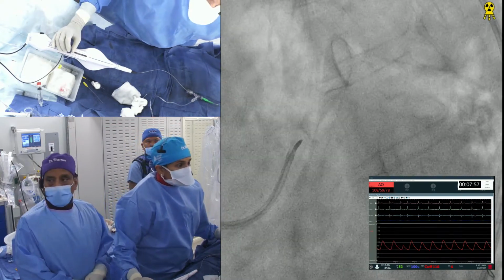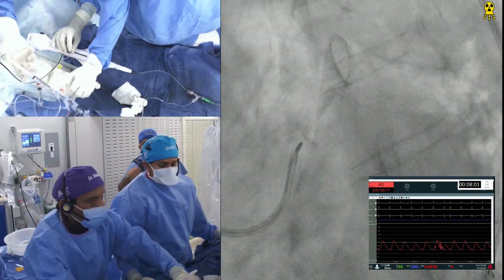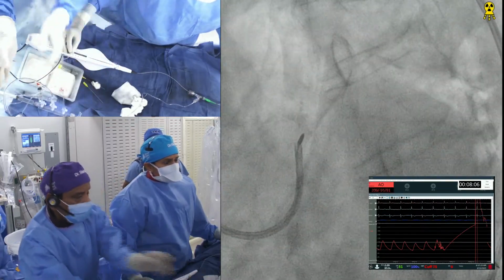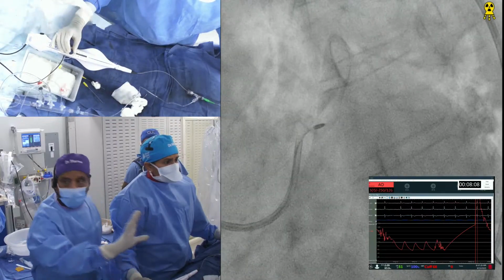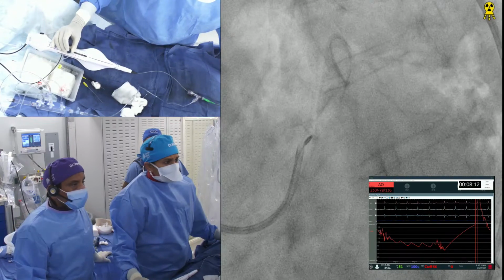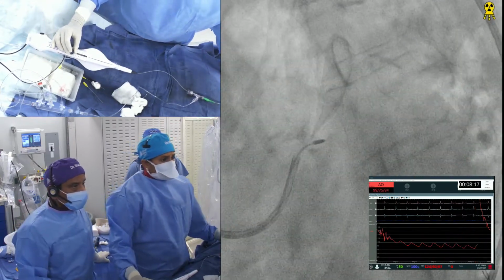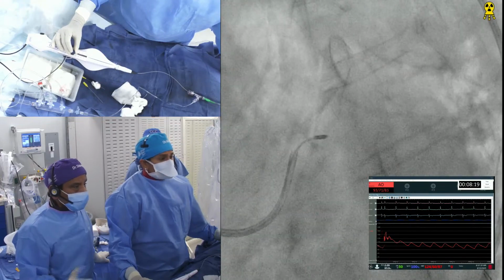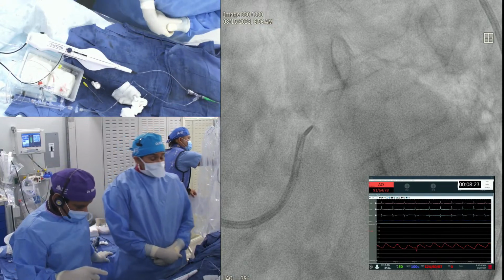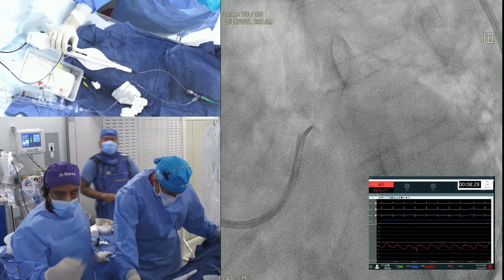Okay. When you start, we're going to go to low speed. You're still far away, yeah. Good, 1 second. We're going 130. Good. We are at 120. Oh, okay. You want to see what I'm saying? Stop. And when you do this, stop, and we come out. Yeah. And get the laser ready.